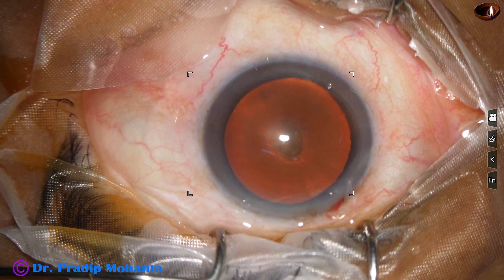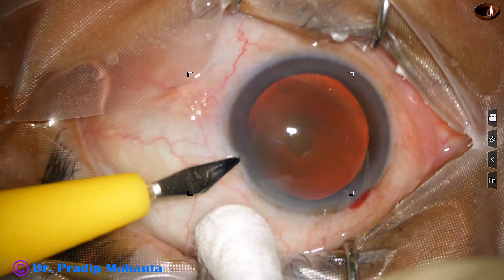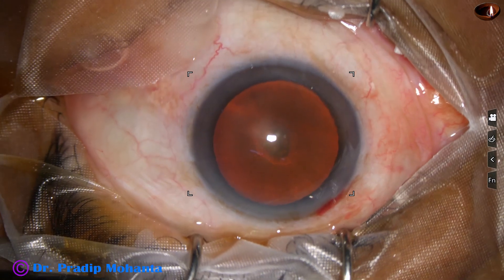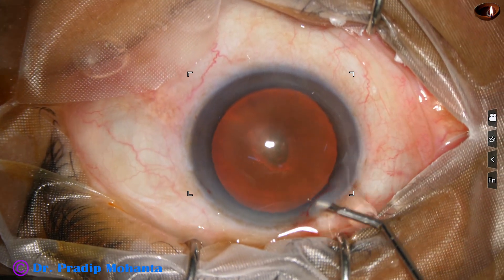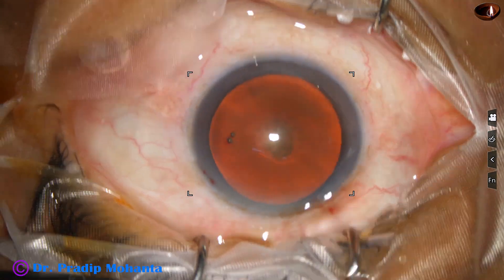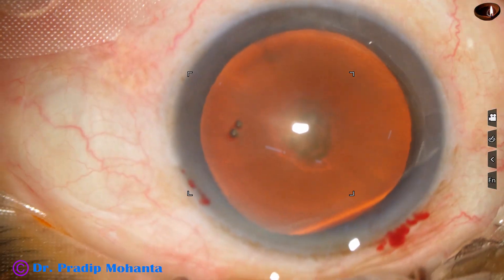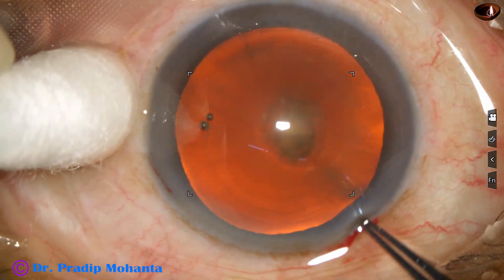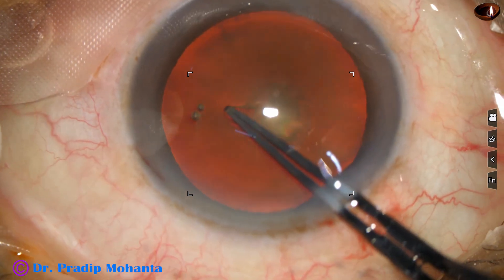The main incision has been placed on the posterior aspect of the limbus, and now a side port is being placed on the left side of the main incision, about 3 o'clock hours away. The anterior chamber is filled up with 2% hydroxypropylmethylcellulose. The microscope is OMS-90 from Topcon, and the phaco machine I am going to use is the Catarex-3.